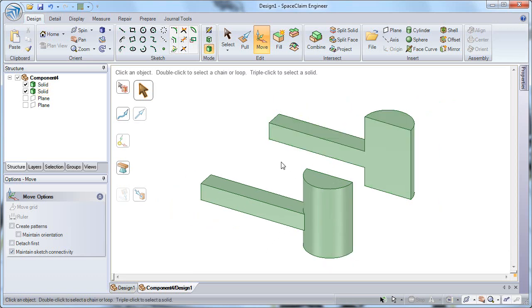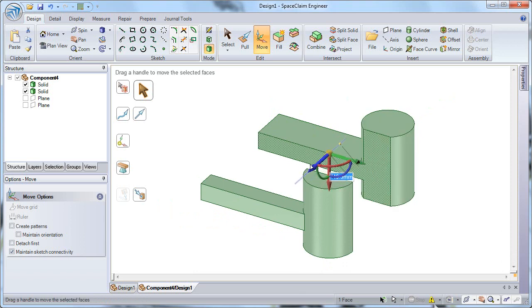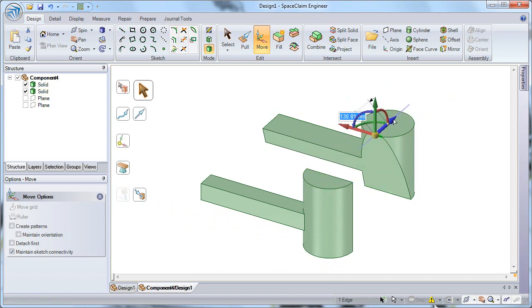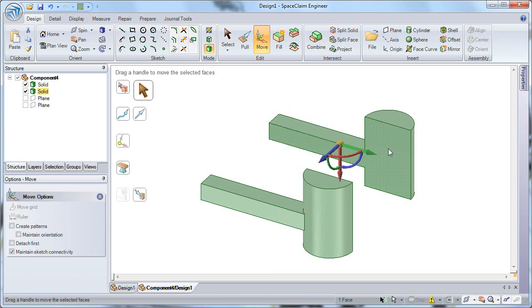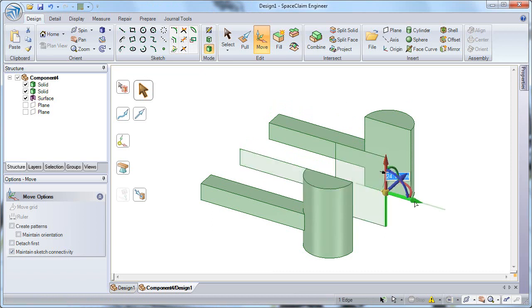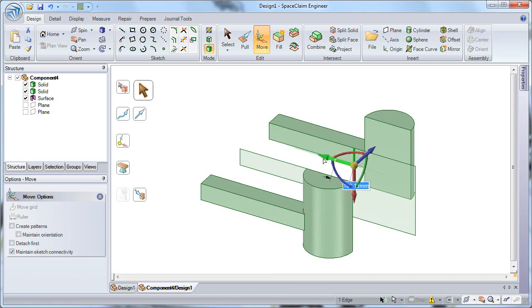You'll notice that with the Move tool, I selected on the entire solid. If I'd selected on a face and moved along the blue arrow, it's going to move that face while following the geometry. If I select on an edge, it'll actually angle that edge by translating it through 3D space. Now if I select on a face with the Move tool and hold Control, same as you saw with Pull before, I'll be able to copy that face inward 300 millimeters to place that in between my two solids. And I'll edit this geometry, or this surface, by pulling out the right-hand side edge a certain distance and pull the inside edge in. And this will give me three faces to create a blend between.